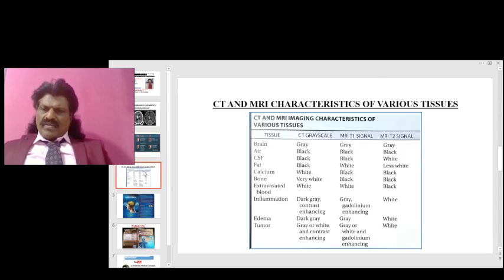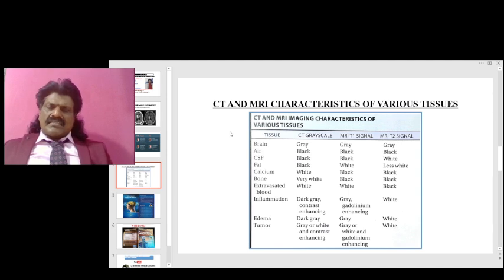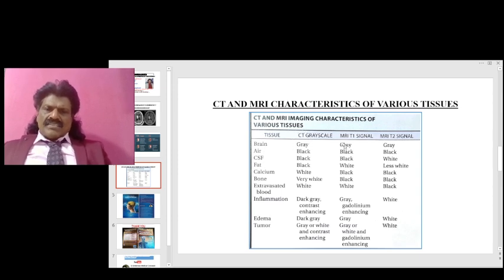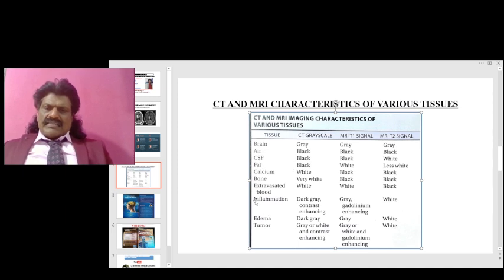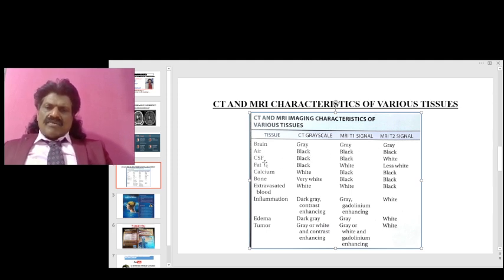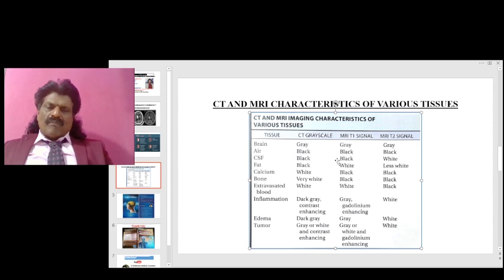Now, looking at the various tissue characteristics on CT and MRI: the brain appears gray on CT, gray on T1, and gray on T2. Air appears black on all three sequences. CSF appears black on CT, black on T1, and white on T2 — which we have discussed in the context of T1/T2 sequences.